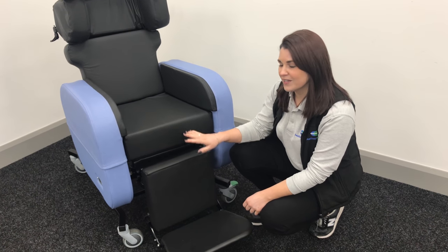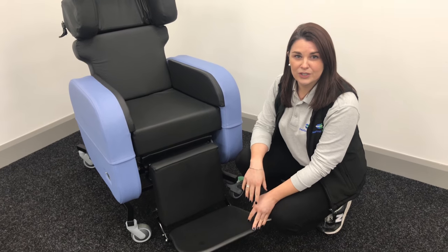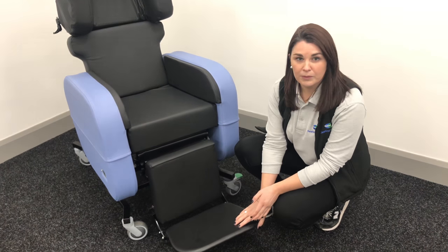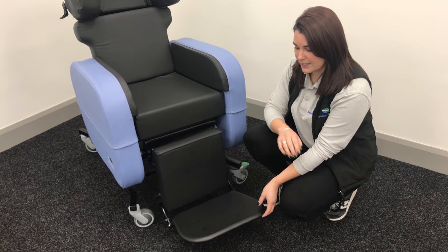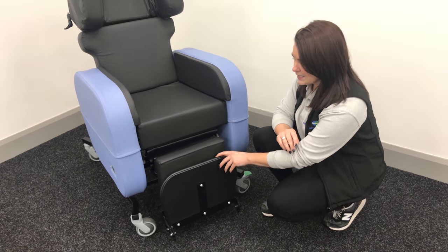This is a video to show you how to adjust the variable angle leg rest and the foot plate. It's really simple to do and designed to do without any tools involved. For the foot plate, if you need to do any stand transfers with your clients, you simply just move it up out of the way — really simple and easy to do.